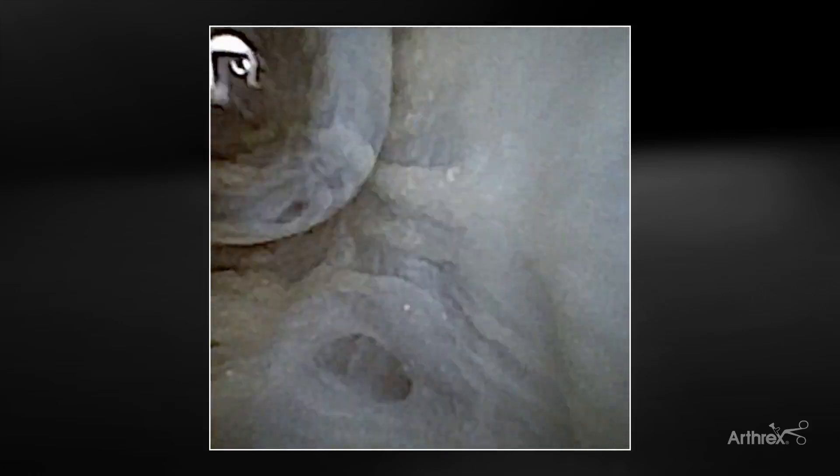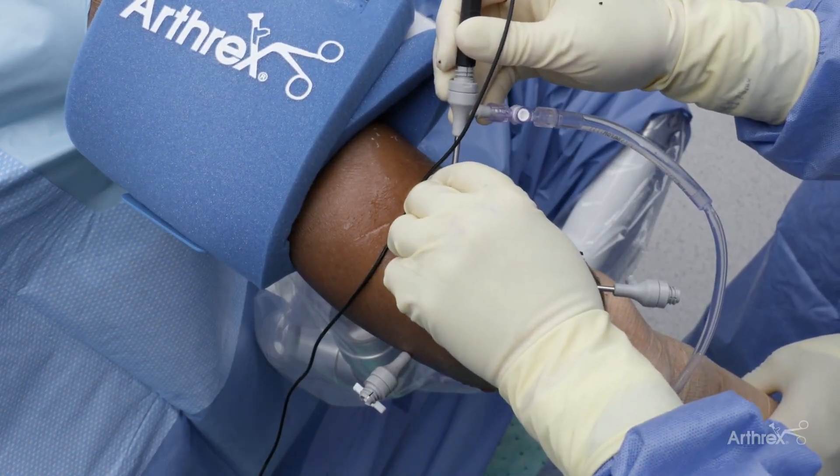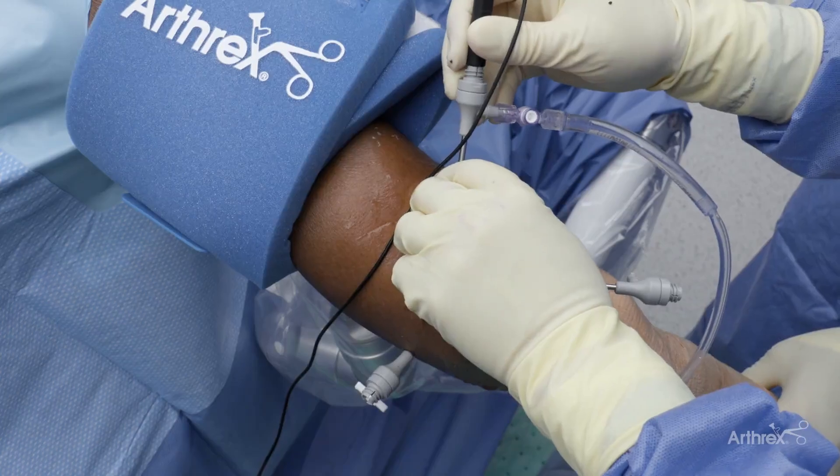Here's our olecranon tip as I'm flexing and extending the elbow. You get a beautiful view of the olecranon tip. There's a little osteophyte there that you can burr off. Then we're going to come over into the medial gutter. Very often you can see the entire ulnar collateral ligament — you can see your bands running from bottom to top. That's your transverse portion, and then your posterior and anterior bands of the ulnar collateral ligament. You get an excellent view of both of those.